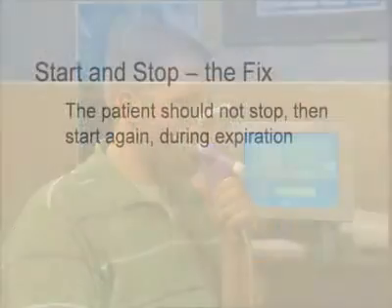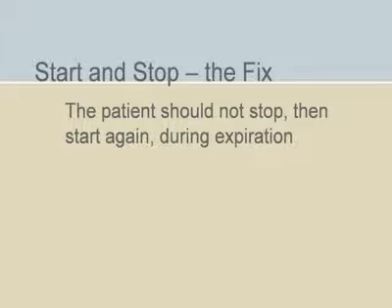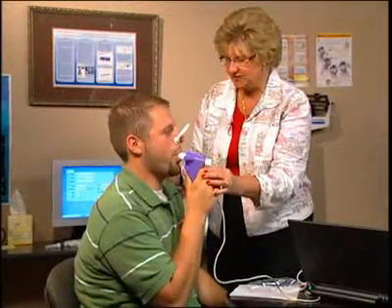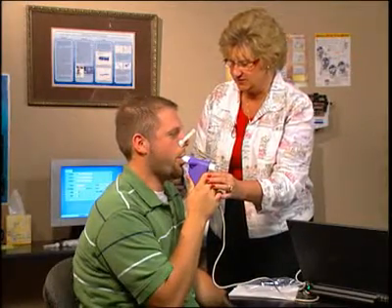Forced vital capacity may be overreported if the patient begins to expire forcefully, stops briefly and inspires, then continues with expiration. Once the patient begins the expiration portion of a test maneuver, he or she should not stop breathing out until the maneuver has been completed.